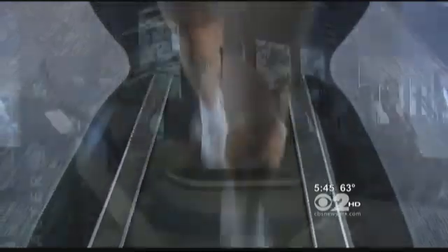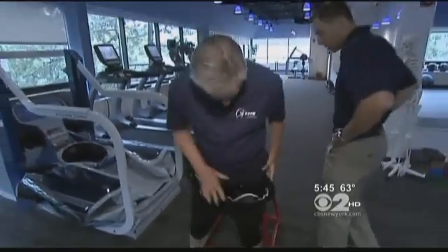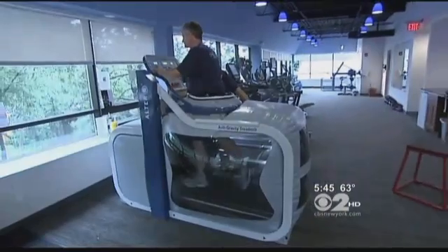That's where this device comes in. It's an anti-gravity treadmill called the Alter-G. It was originally developed for NASA to help astronauts ease back into Earth's gravity — slowly introducing 70 percent, 65 percent of your weight back, until the walking mechanics are normalized. The key element is neoprene shorts with a kind of skirt attached that gets zipped into the air chamber surrounding the treadmill. That forms an airtight seal, and as the chamber inflates, it lifts you, reducing the amount of body weight your legs have to carry.